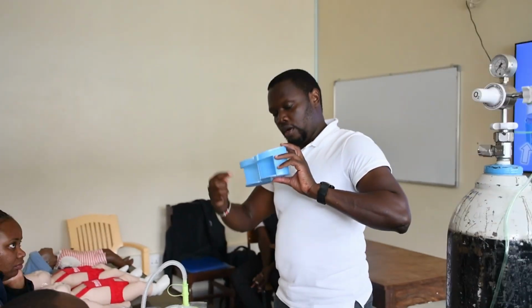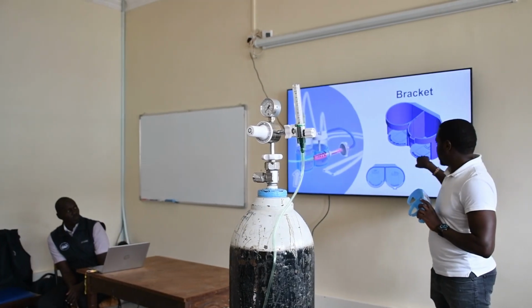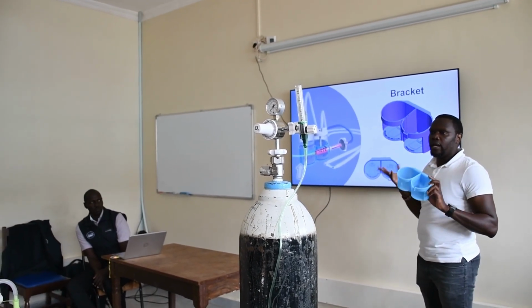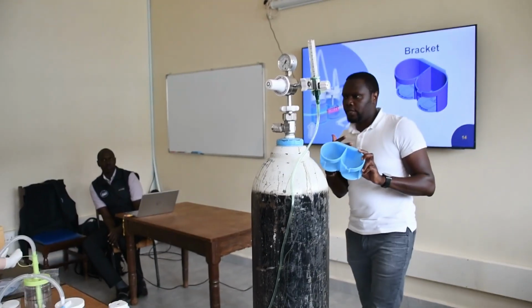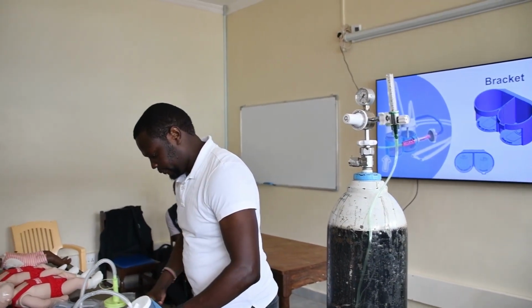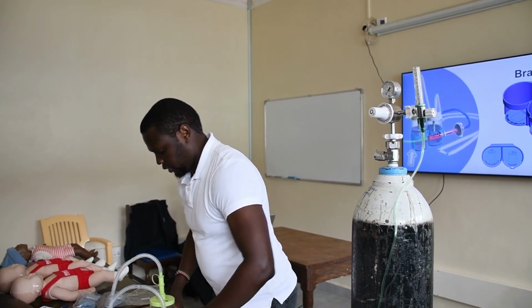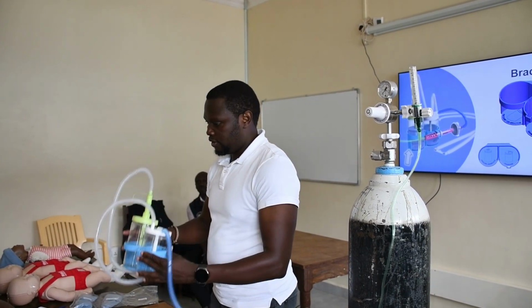So in here you have writings on it. There's a humidifier, pressure generator. That is to guide you what goes where. So the humidifier bottle goes in there. Then the pressure generator goes in there. Now you have your bottles held.